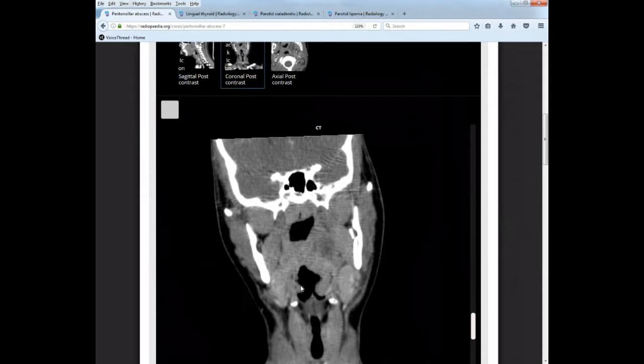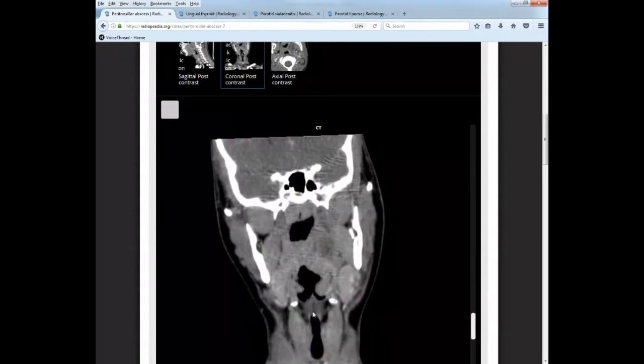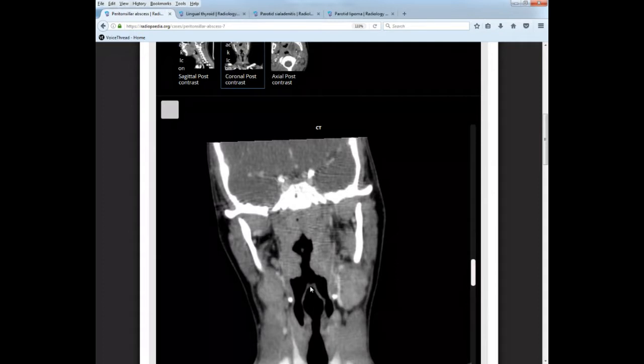And then as we travel posterior, or towards the back, you're going to have these two bigger pouches. Those are your piriform sinuses. And then this is your epiglottis. Okay, epiglottis attaches anteriorly right here. And as we travel posterior, there it is. And remember, it's going to flap backwards to close off the opening to the trachea.